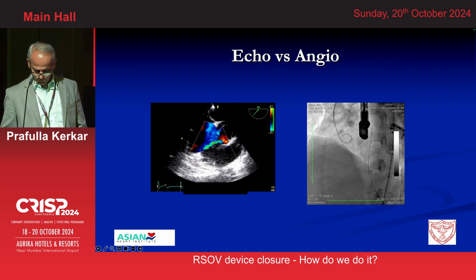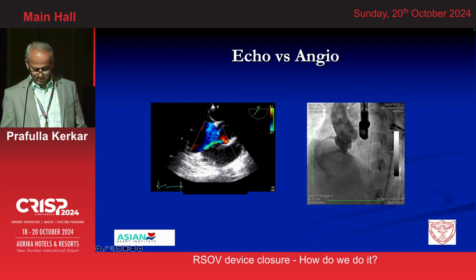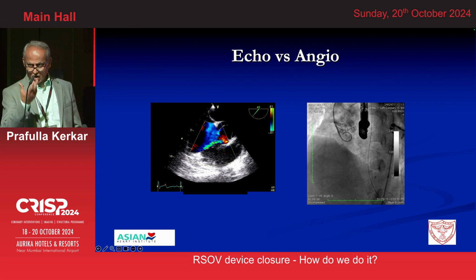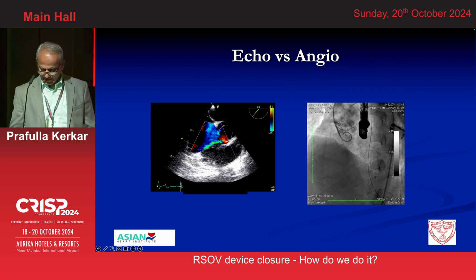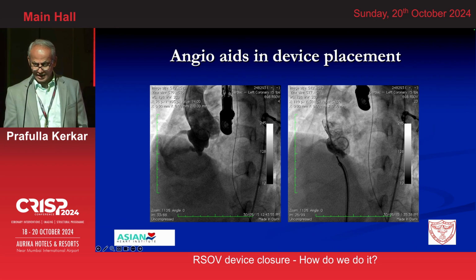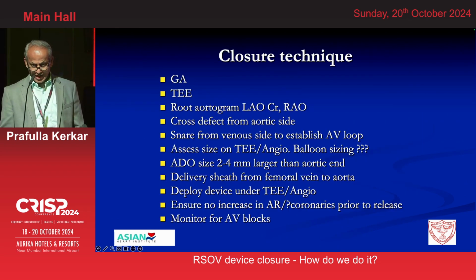And what has happened here is that we think it's a very slam dunk kind of a procedure. But if you look at the angiography, you see that there are not one but two aneurysms, one unruptured one, all coming from a common aortic end. And therefore, we could oversize the device. Instead of an 8 by 6, we put in a 10 by 8 and managed to seal off the entire aneurysm completely. So as far as the closure technique is concerned, it's fairly simple.